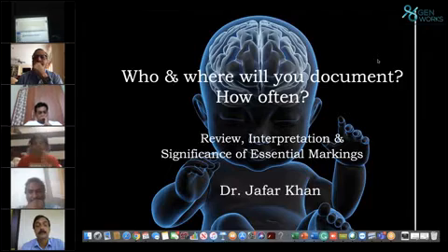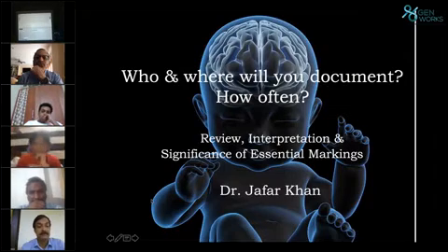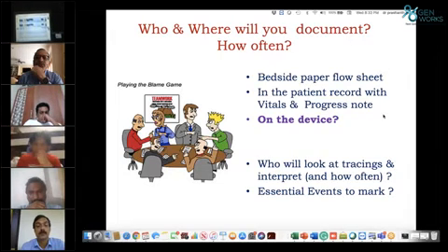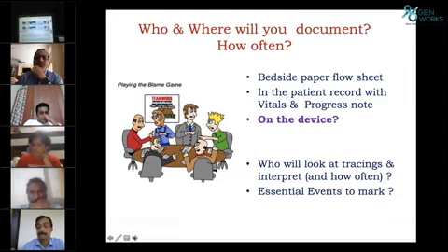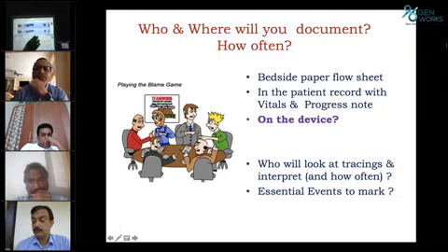Hello. She should be able to attach all the leads properly, and she should be able to document the normal trace as well as any abnormal trace as per the gestational age or as per the history. So first she should be able to take the history, what is the baby's history, and then she should be able to document. So what to document, already Dr. Amit sir told that 5S, that seizure pattern or that background pattern.